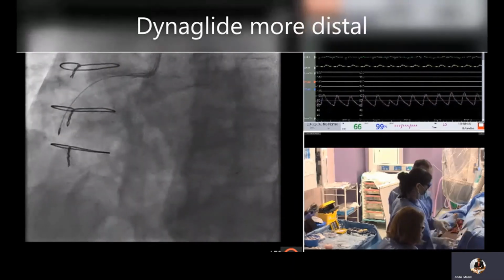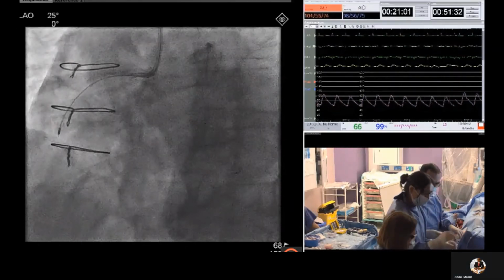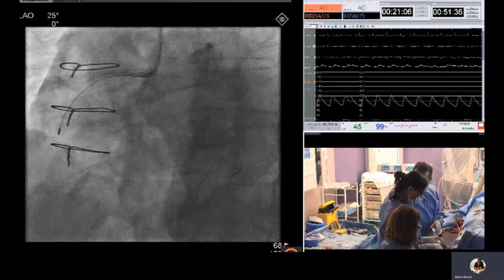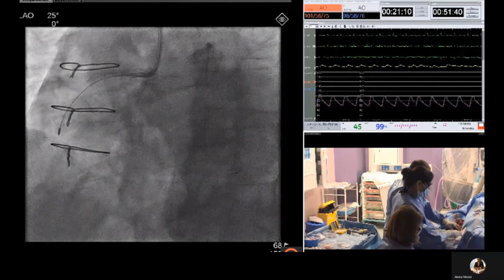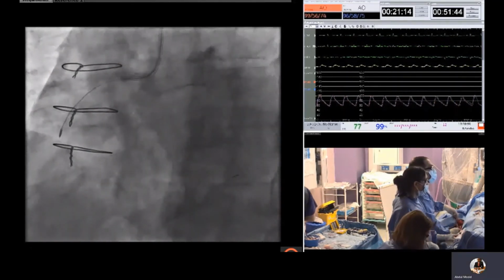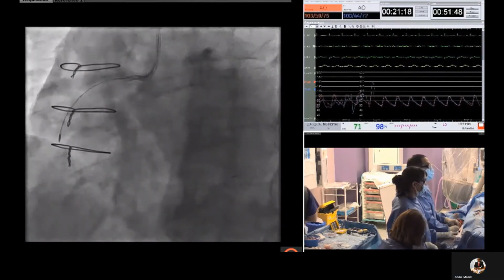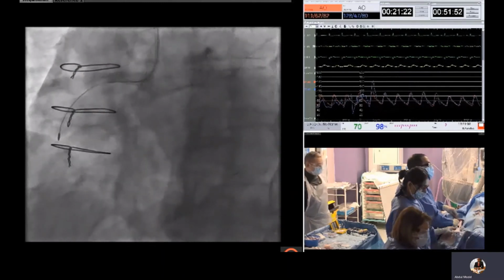However, we have run out of length on the Rota system, so we then performed the Dynaglide maneuver to advance the burr more distal, which will then give us more length to perform rotablation to the distal vessel.